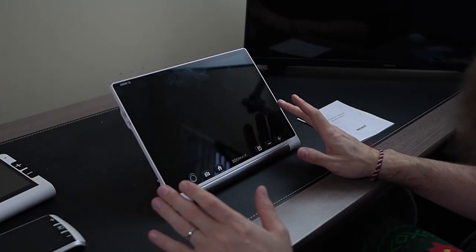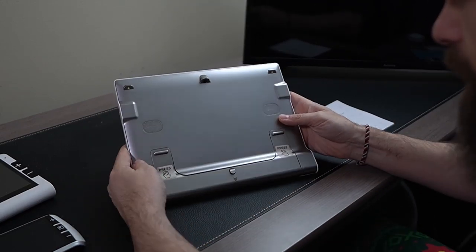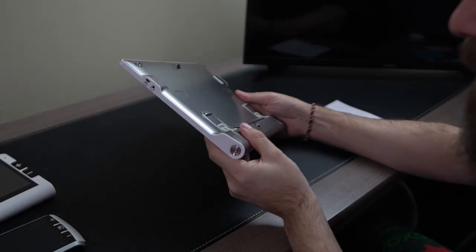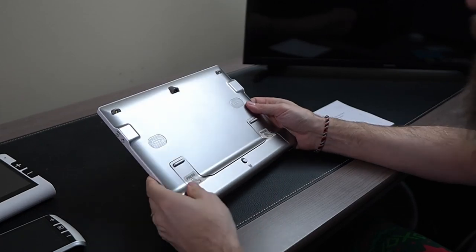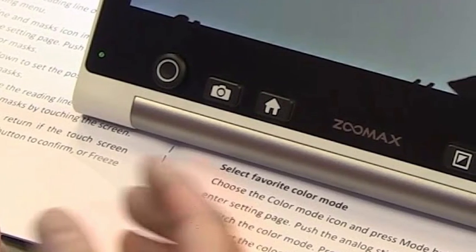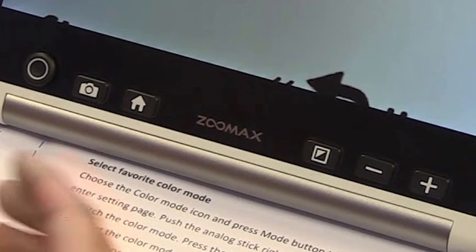Let's take a look at the big guy, the 12-inch. The 12-inch is definitely the one I wanted to spend some time talking about because it has some unique features the others don't. First of all, it has a very sturdy construction and it's also pretty lightweight and thin. There's a bulge at the bottom for the battery, but the rest of the magnifier is quite thin. On the front we have a joystick, a camera button, a home button, a color contrast button, and the plus and minus zoom in and zoom out buttons.